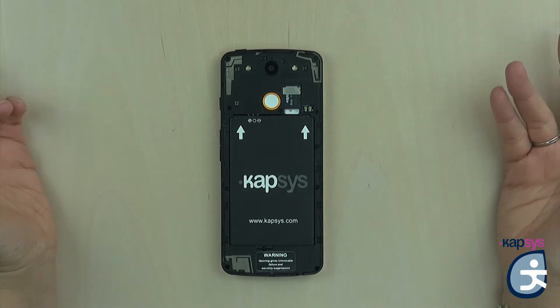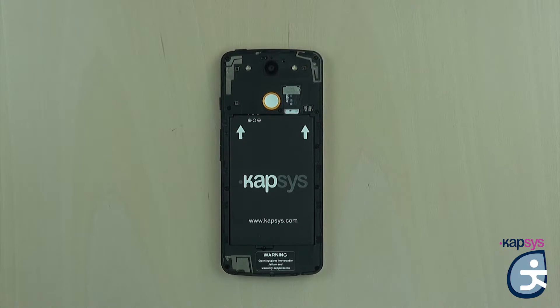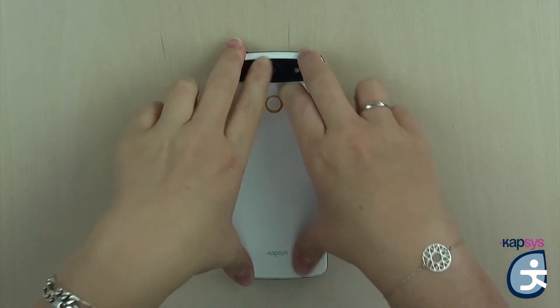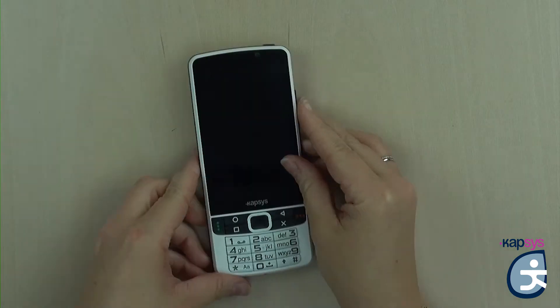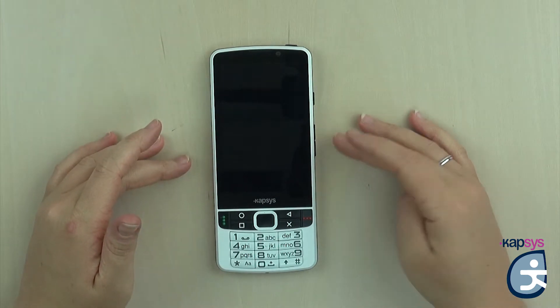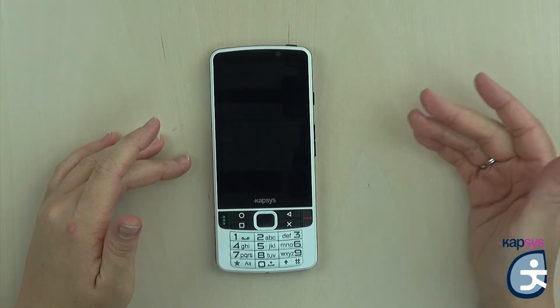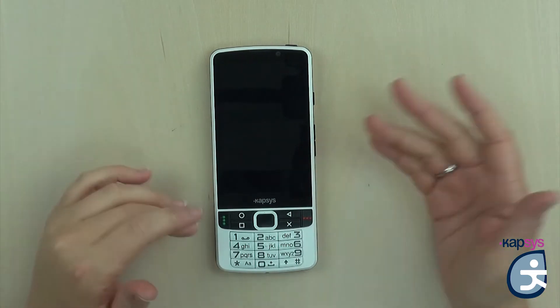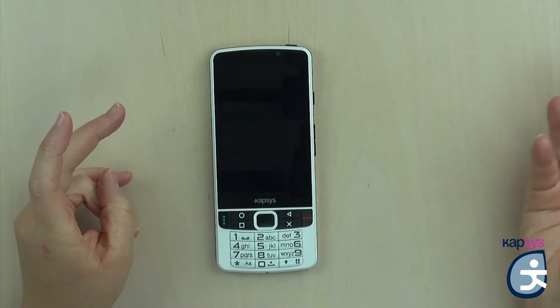Now the product is operational. Before starting the Smart Vision 2 and seeing the start-up tutorial on the first configuration, we'll see together how the Smart Vision 2 is built. In front of the phone, you have a large touchscreen. Blind people will be able to explore it by touch, and the visually impaired will view the contents of the phone as the touchscreen supports large display and text enlarging features. This phone can, of course, also be used by sighted users.